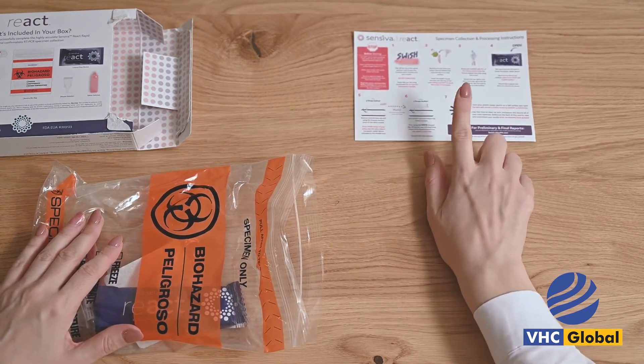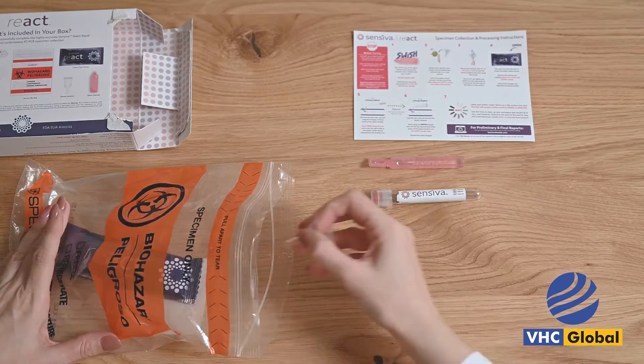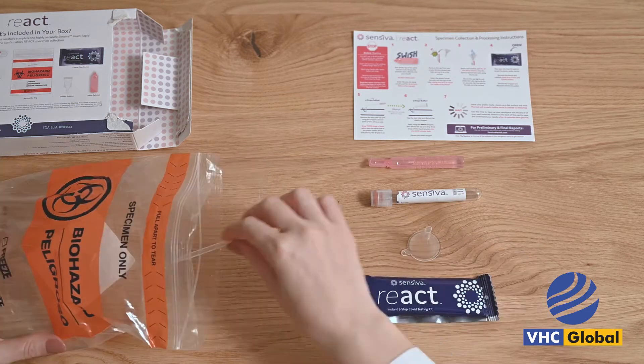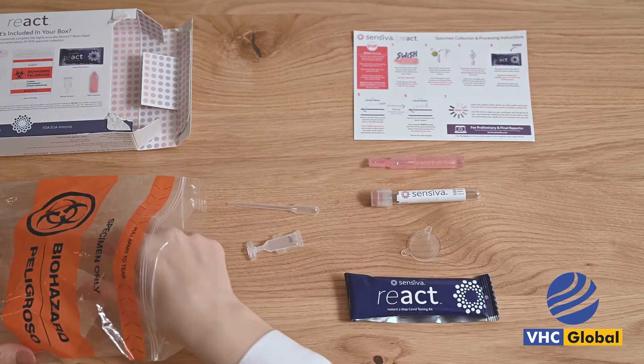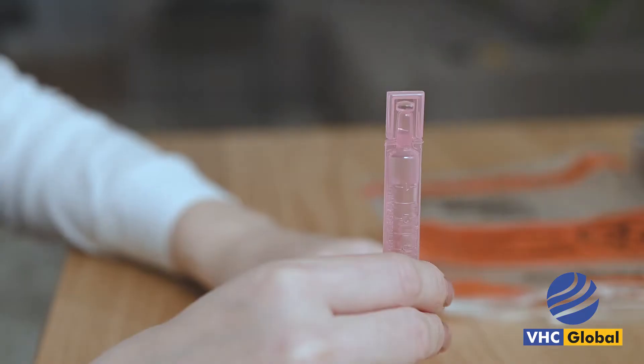Read the instructions in the bag before you start. Before starting, do not eat or drink anything except water for 30 plus minutes before sample collection. Clean and sanitize a flat working surface larger than 2 foot by 2 foot. Wash your hands with warm water and soap.